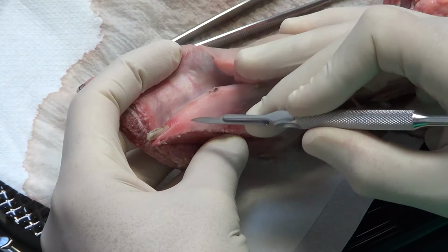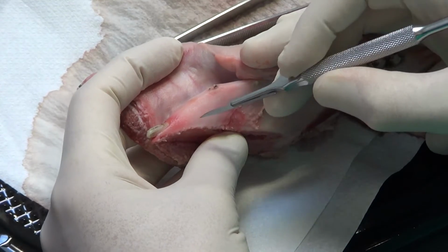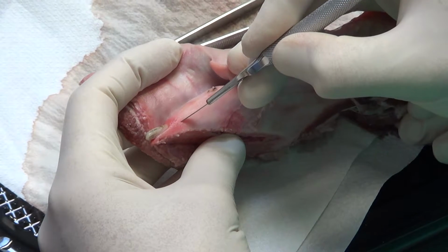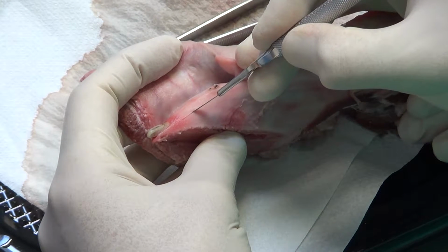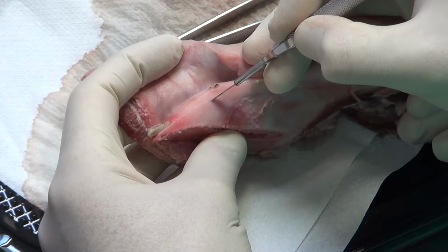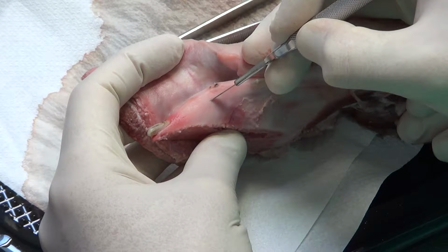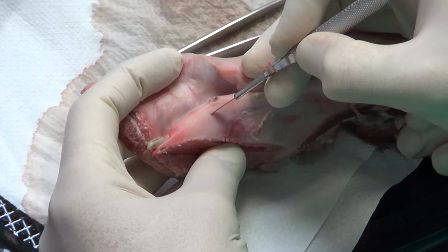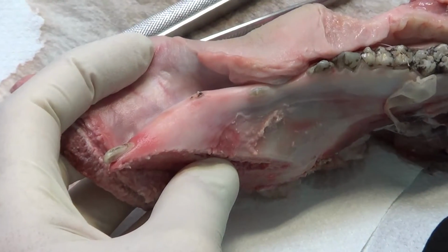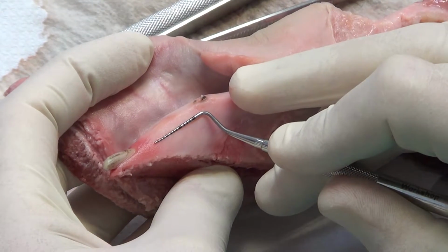Okay, so we stay lingually, like in the mouth. The first incision will be, as we did before, a normal single incision. You can measure before if you want. For example, we want to obtain 1 centimeter of epithelial connective tissue. We measure with the probe 1 centimeter, 10 millimeters.